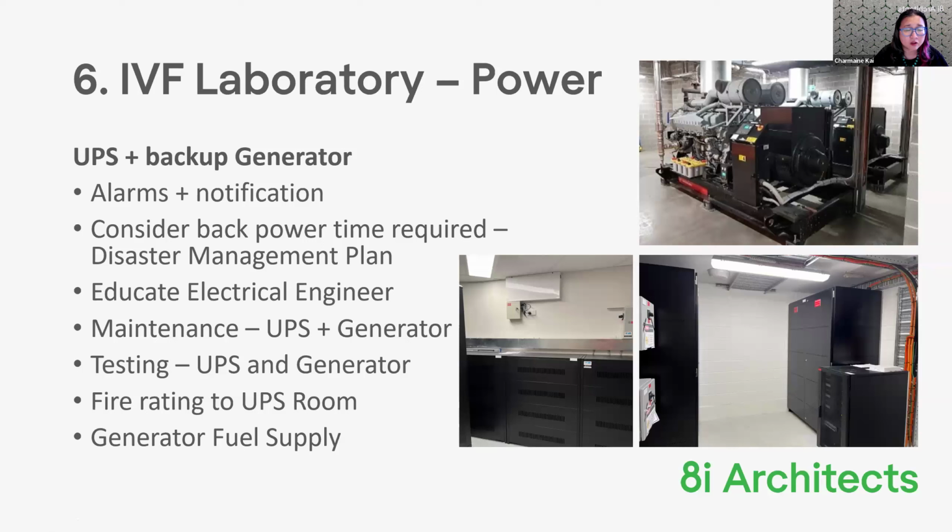A lot of times for UPS backup, and this is where you kind of need to educate your electrical engineer as well, is the requirement for backup. So really the time you need to back up with a UPS is really disaster management. In general, most electrical engineers think of UPSs as connected to computers. So generally the UPS only lasts for a few minutes, maybe 10, 15 minutes max. As you know, it's not the case with IVF labs because we have to run our incubators 24/7. They can't stop.